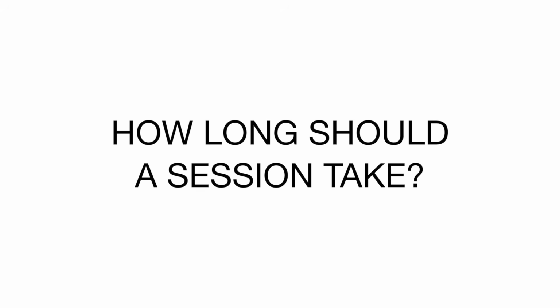Now, I know your next question might be, how long should it take? Unfortunately, there isn't really a specific amount of time I can give you, again, because everyone's a little different. Some moms can pump really efficiently in around 15 minutes. I've had clients who have gotten really good at this process, have really solid milk supplies, and in like 15 minutes, they're done. Others may take upwards of 40 minutes. I usually tell the moms that I work with, if it takes over 30 minutes to fully empty your breast, there's clear room for improvement there.